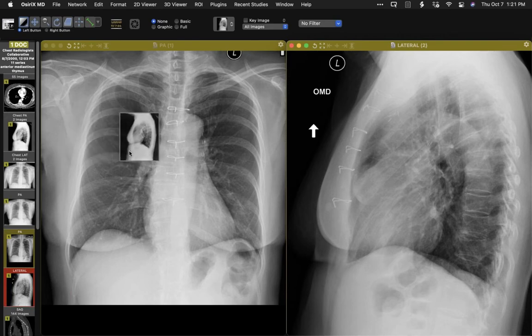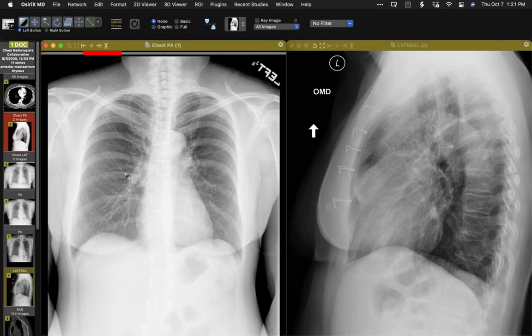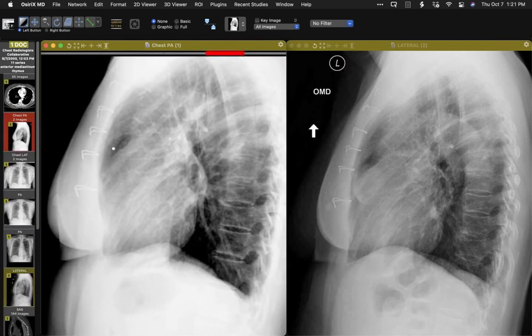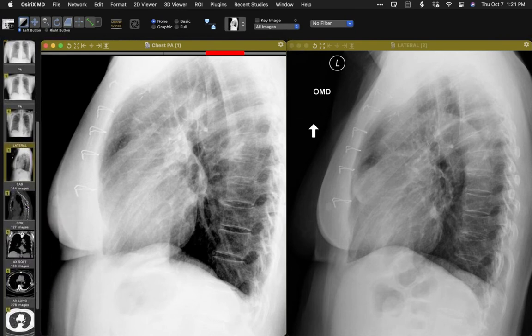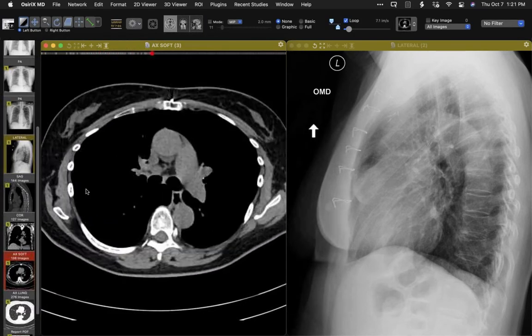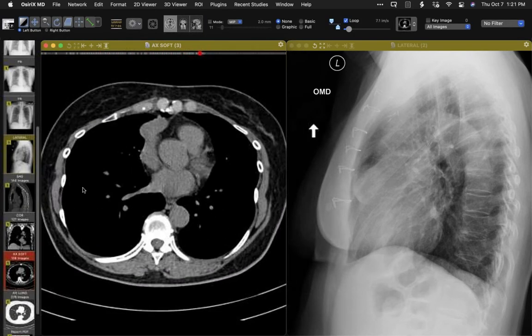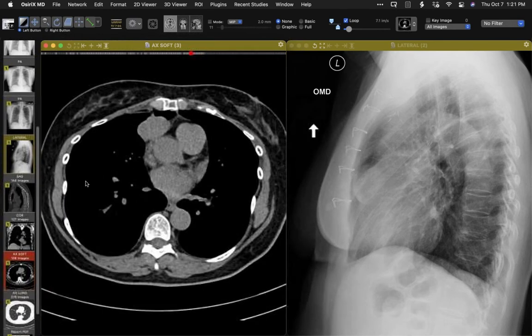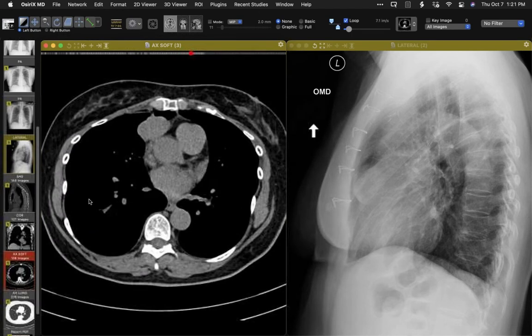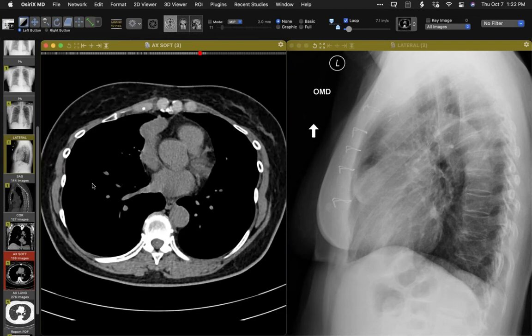And to go back to the lateral from before 2005, I'll bring that up. You can see the opacity is new. So a new opacity, but a patient with sternal wires. So you might, of course, ask, why did the patient have the sternotomy? And indeed, you're probably thinking of exactly what this is, which is recurrence of thymoma. So here it is. Now, the patient had that thymectomy in the 1990s, and this isn't that unusual. These are slow-growing things. Recurrence may occur years later, or at least the lesion may grow very slowly over time.